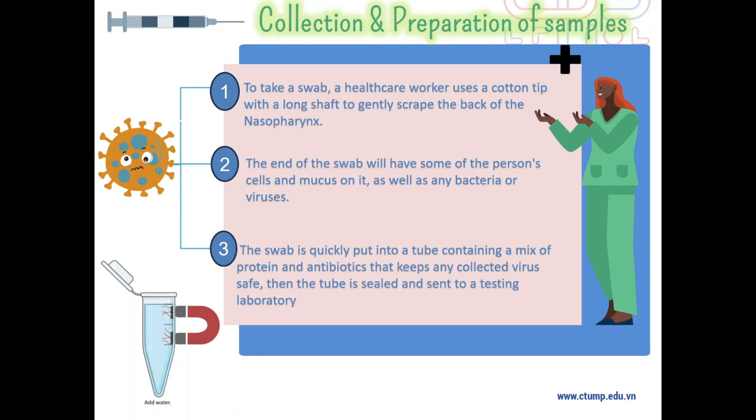However, sometimes the virus might be multiplying in places away from where the swab is, or there is not yet enough virus around for the swab to pick up. So, a negative test might mean that you don't have coronavirus, or that you have coronavirus and it just isn't detectable yet, or the wrong part was swept.